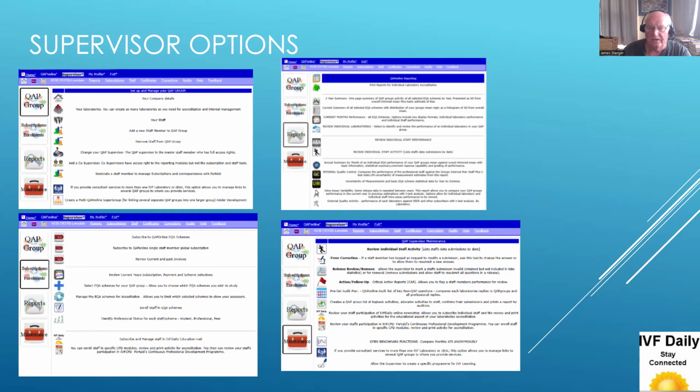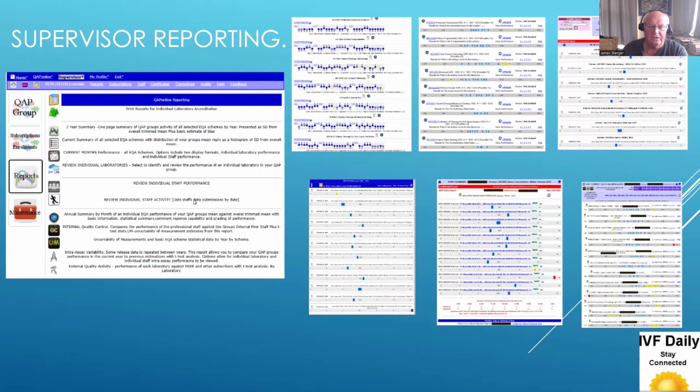Some of these things I think I've developed over time, but no longer am I interested in them. I think that they haven't been something which clinics have looked at. So I explored the ability to do some of these things, but a lot of these things don't work anymore. And there is a maintenance thing where you can do error correction and you can do, mark for follow-up. I was really keen on that back in the 2005 to 2015, but in the last 10 years or so, I've become less interested in that. But this is what you can do.